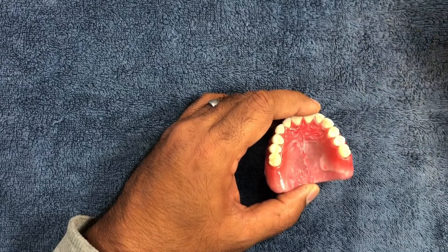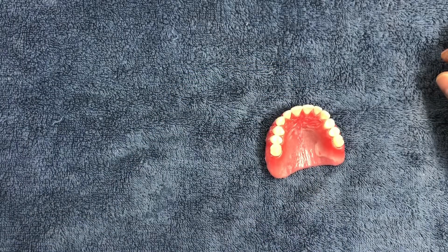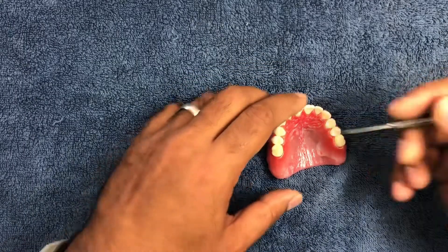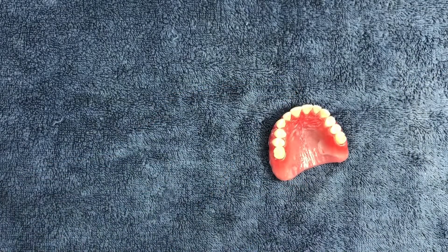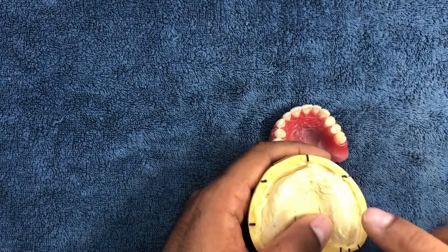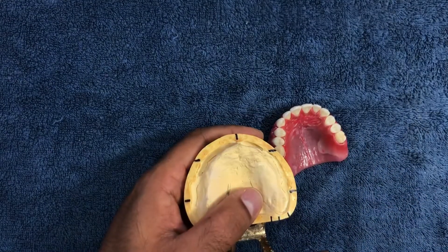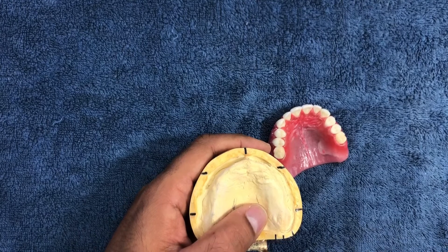So what I do and how I do it: one way is just plain freehand laying it down. I would suggest, if you're doing it, definitely look at the models of the patient and work from there — don't just imagine and do it.